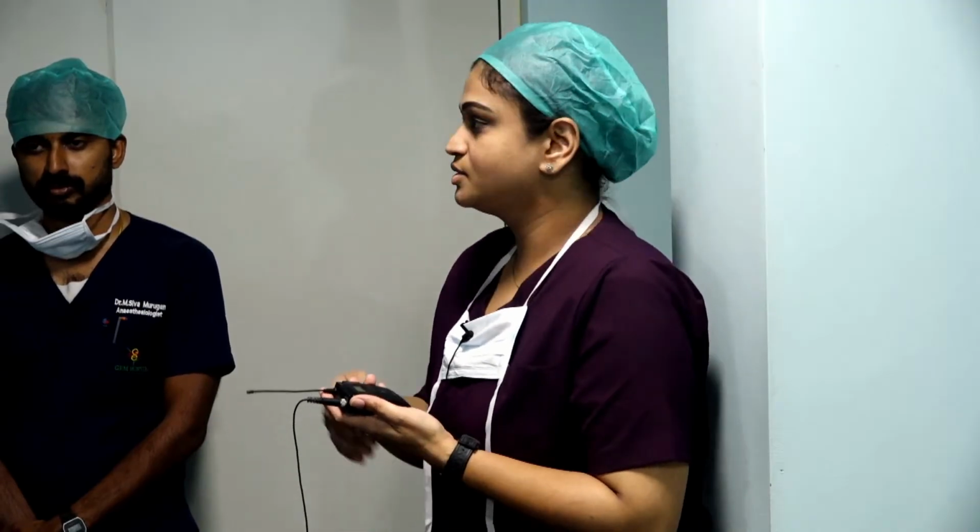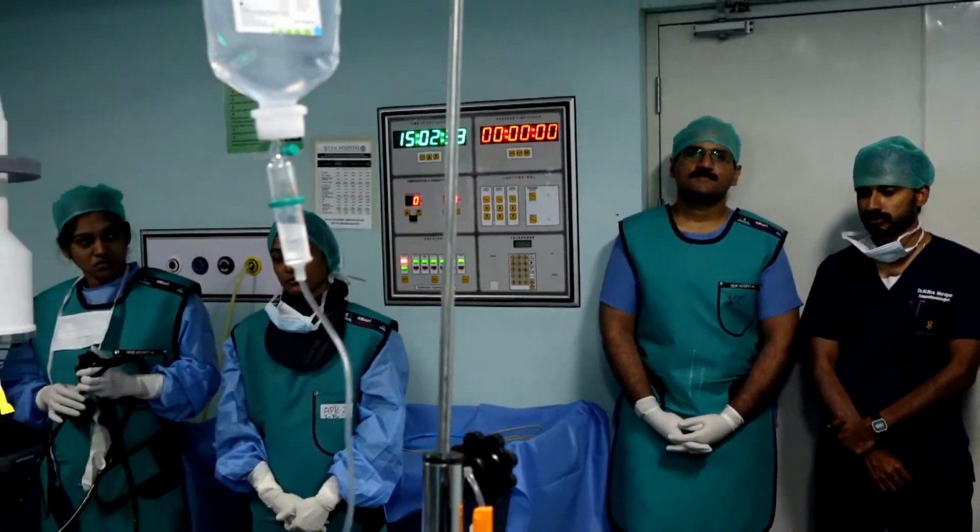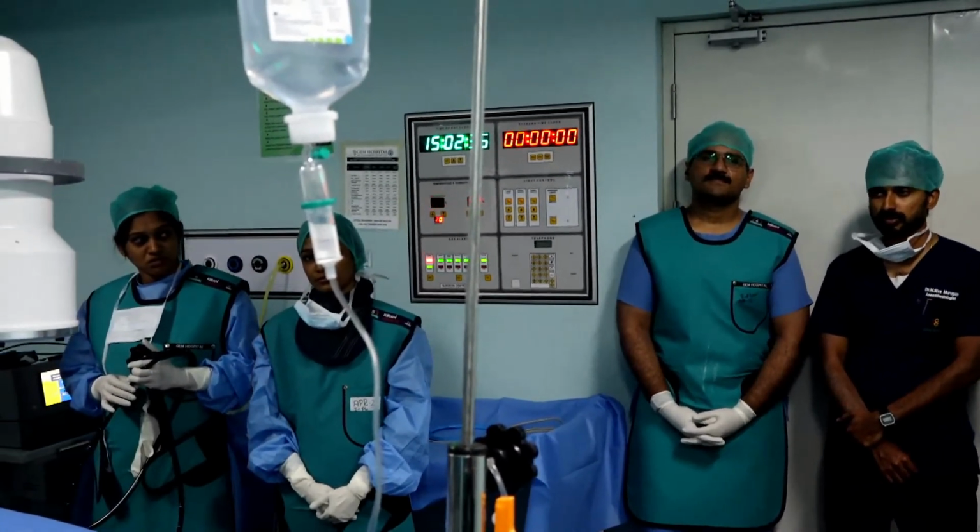Let's introduce you to the team. We'll have on the scope end Dr. Sridhar, the medical gastroenterologist who will be performing the ERCP. The anesthesia team is led by Dr. Shivmurugan sir, and we'll have at the endoscopy technician end Mrs. Chitra, Mrs. Albi and Mrs. Anju, and Mr. Ranjit at the CM from the radiology clinic.